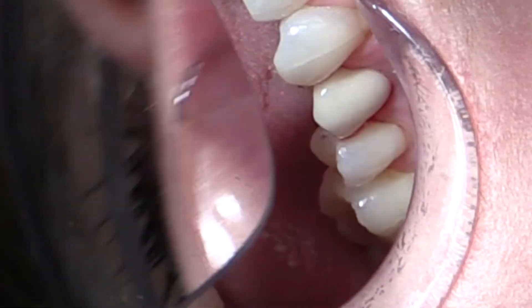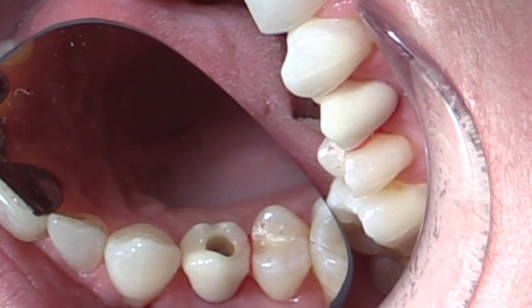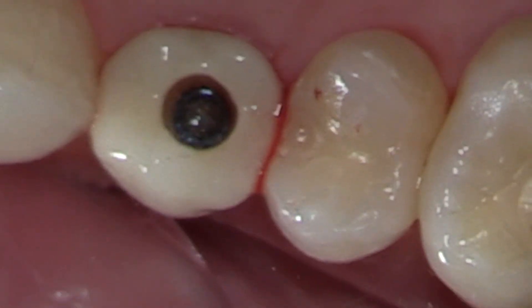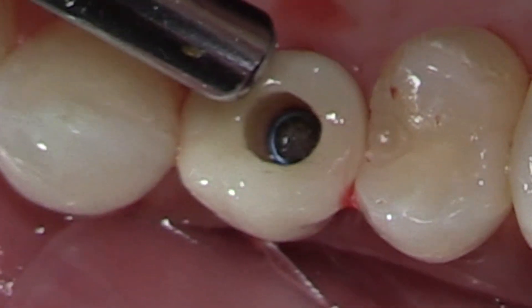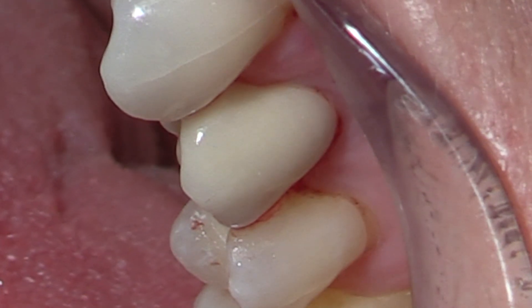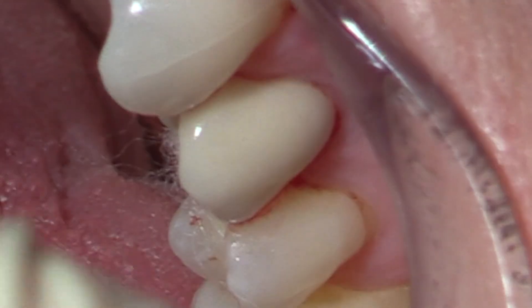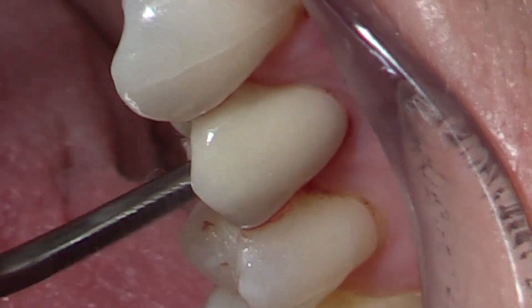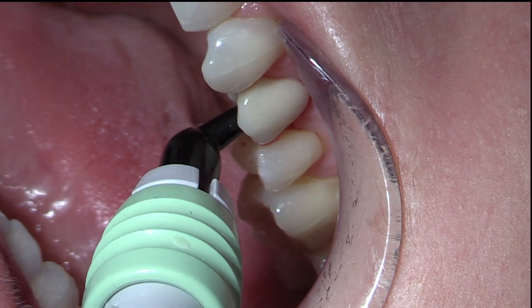The ASC is providing some very beautiful aesthetics. The soft tissues have been maintained — nice papilla, and the connective tissue is still there. Looking inside, we can see the OmniGrip screw — this blue screw is so important to this whole assembly because it enables you to tighten on an angle. When restoring, we place a little bit of cotton inside the channel to make sure the screw is covered before you put the composite in place. We then place some composite, cure it, and ensure the patient has long-term success.